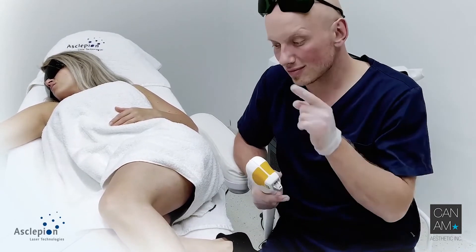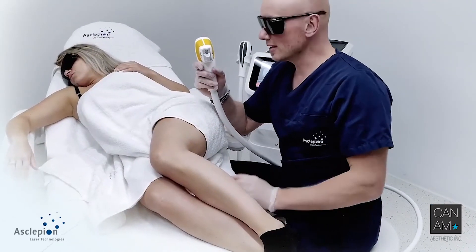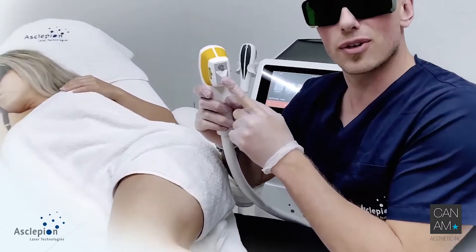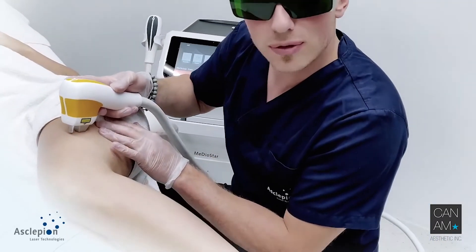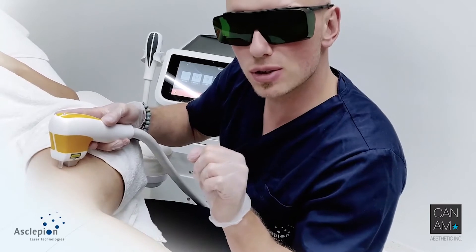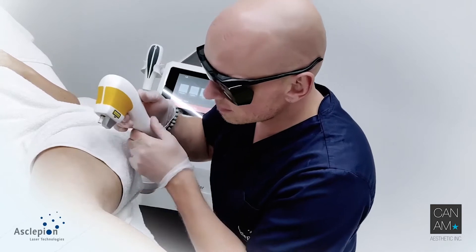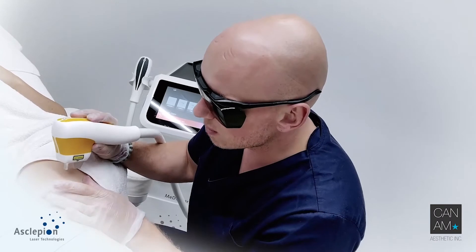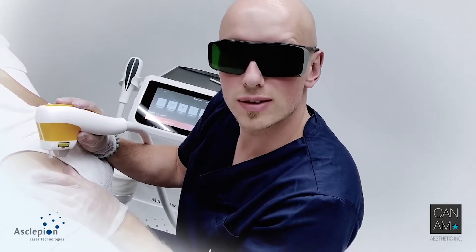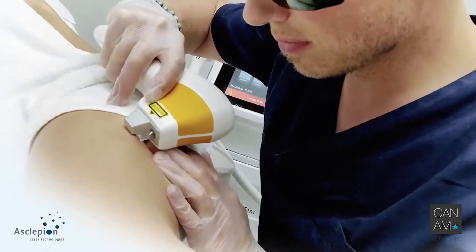In this case, let's start with this patient. Let's start the treatment. First things first, and first thing is cooling. We have applied some gel. We pre-cool the area first. Don't press too much — pressure causes compression on the vessels. After pre-cooling: deeper vessels, 90 degrees; more superficial vessels, 45 degrees. Here we go.